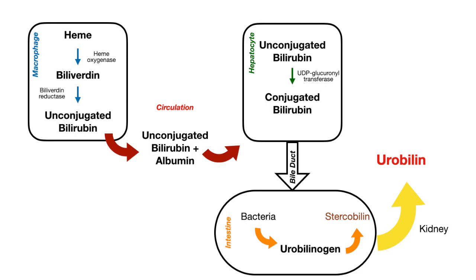The normal color of urine ranges from a pale yellow to a dark amber color, depending on how hydrated or dehydrated an individual is at the time. And just keep in mind that a urine analysis is a snapshot in time, so it indicates an individual's hydration status in the moment in which that urine sample was collected. So what are some things that we can see on gross inspection of urine?